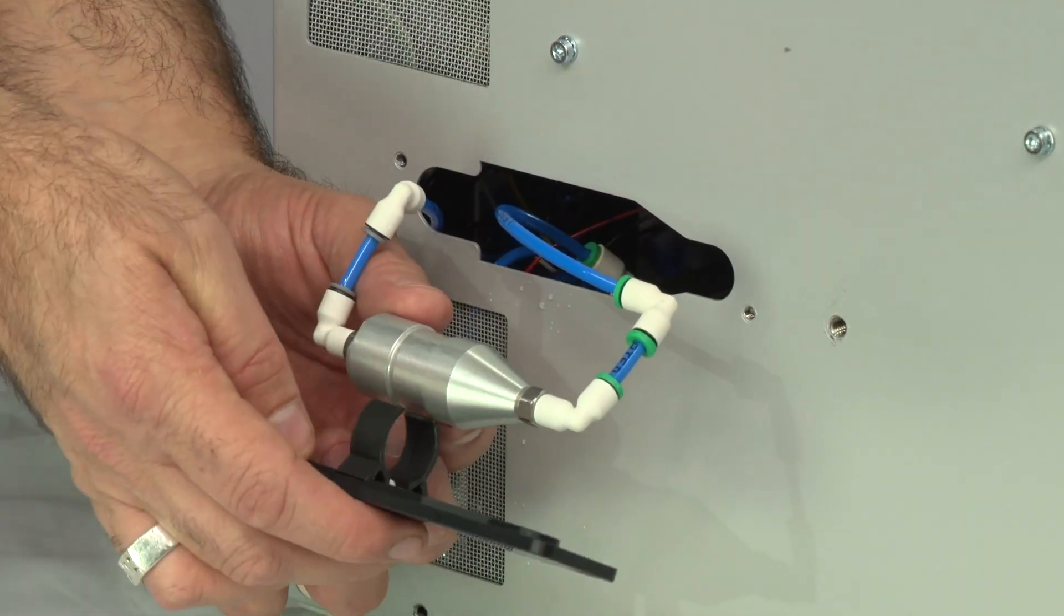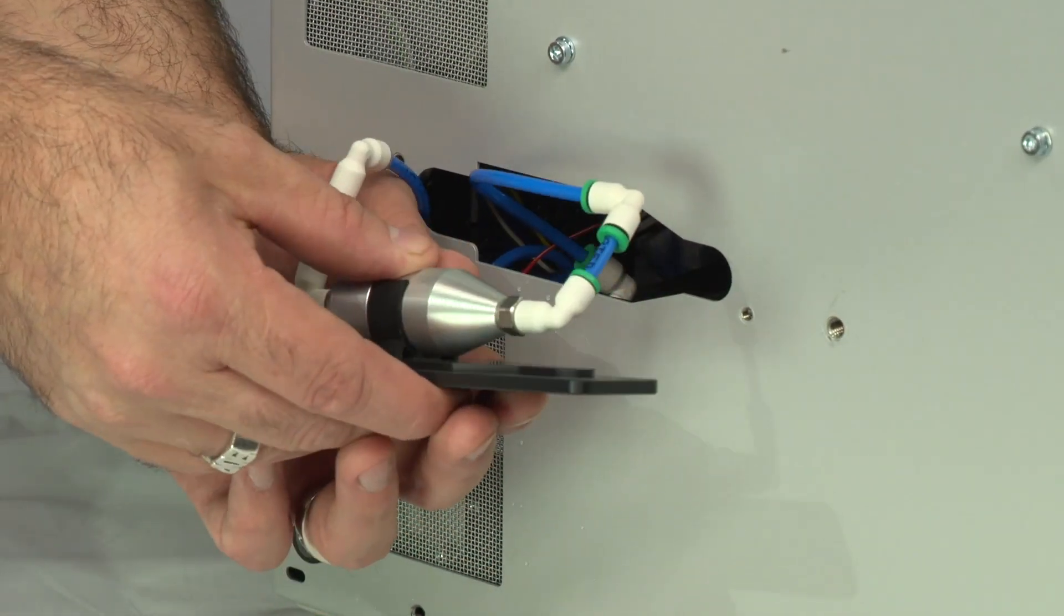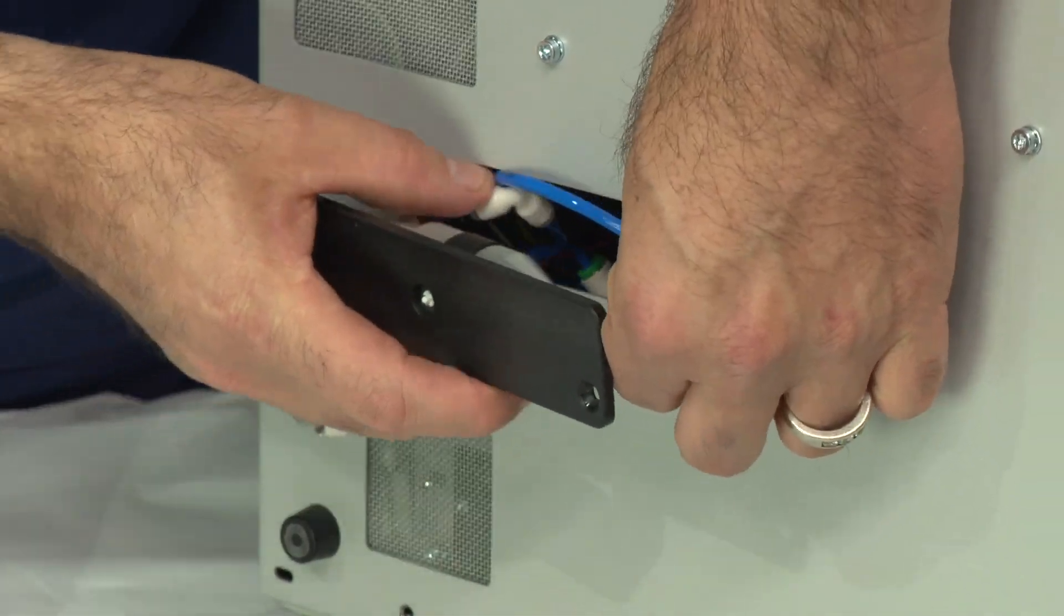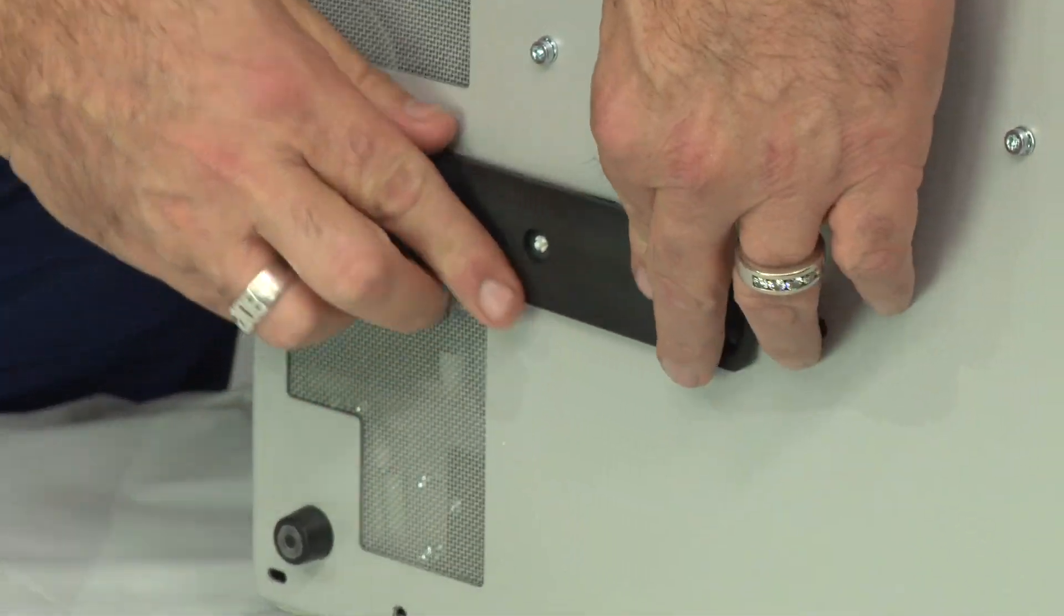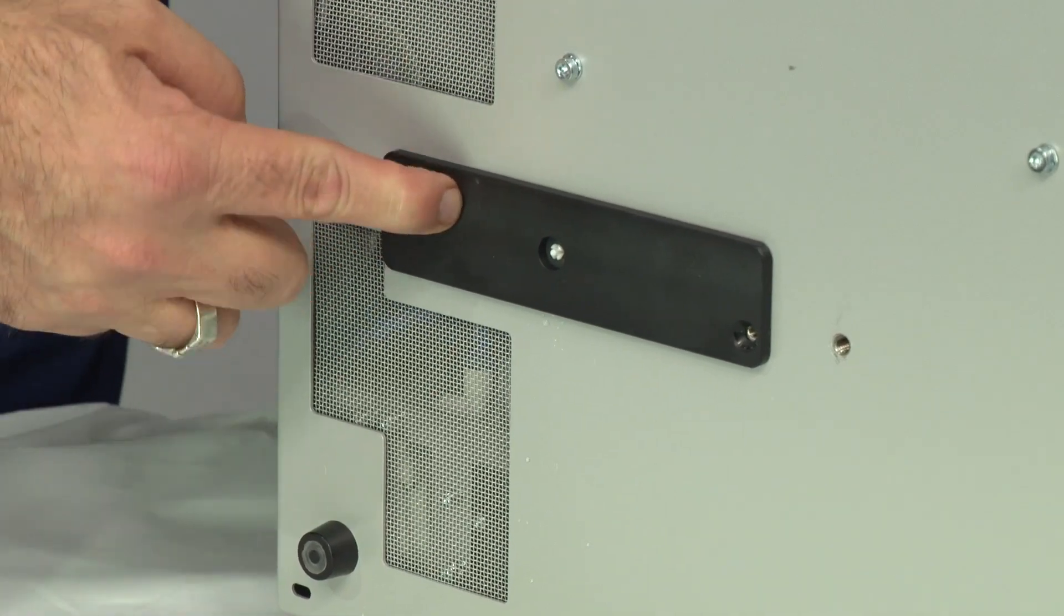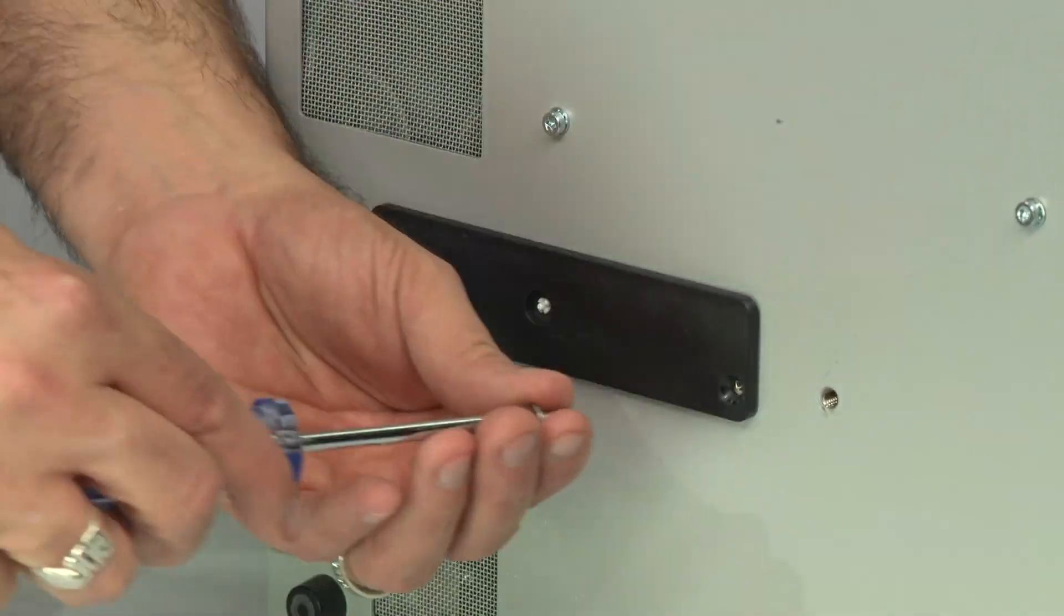Attach the cover to the new filter and place in the chamber. Screw and tighten the water filter cover using a Torx tool size 20.